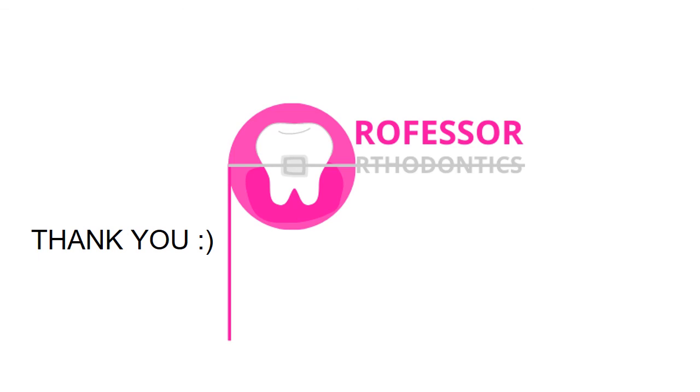So I would like to conclude this lecture with the fact that orthodontic retention is an ongoing orthodontic active treatment. So removal of fixed appliance is not the end of orthodontic treatment. It is very important to educate the patient that he or she plays an equal and important role in maintaining the orthodontic correction by following the instructions and wearing the retainer. The longer the patient wears the orthodontic retainer, the longer he will benefit from the orthodontic correction.